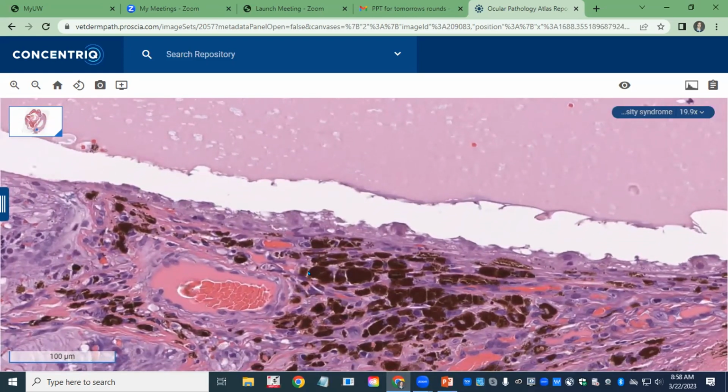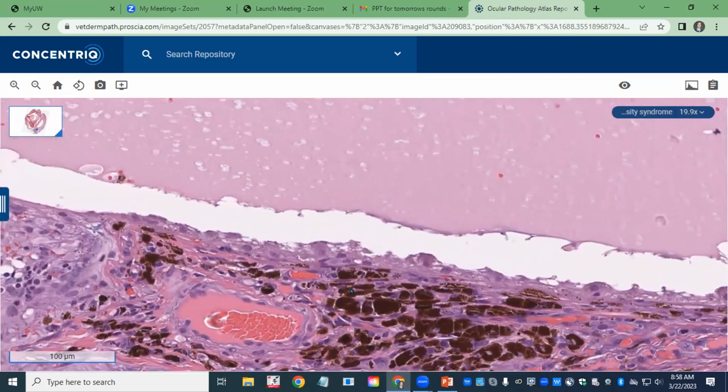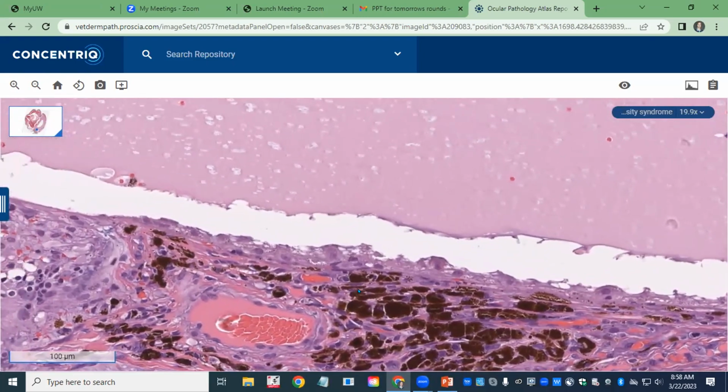So the hue of the serum in that blood vessel right there is similar to the hue of the protein that's in the eye. And you pick up the PAS too in the vessel. That is an indication that whatever's in the vessels is high protein, i.e. higher protein than it should be in this case because of Ehrlichia canis and probably immunoglobulins. And then it's a similar consistency of what has leaked into the eye.